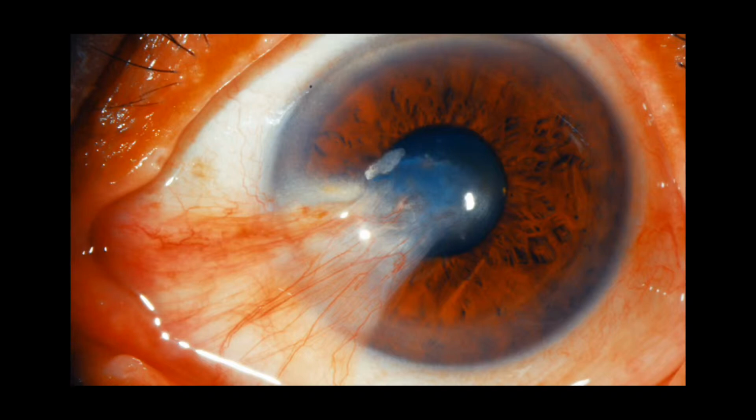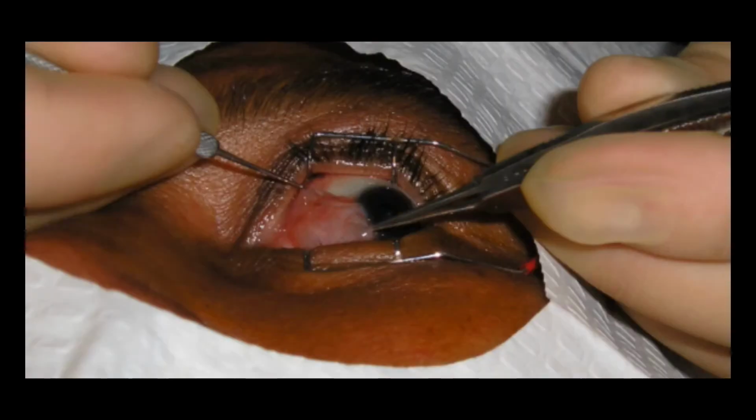Basically, we'll go in with minor surgery and lift this off and then polish over the cornea where we take it off. When we remove it surgically, we lift it off and it can leave a defect on the cornea itself. Then we polish that with a diamond-studded burr, which is a spinning ball that polishes the cornea to a nice smooth finish. And then we'll use a conjunctival autograft, which is the conjunctiva from somewhere else, and place it over the defect where we remove the pterygium to prevent regrowth of the pterygium.